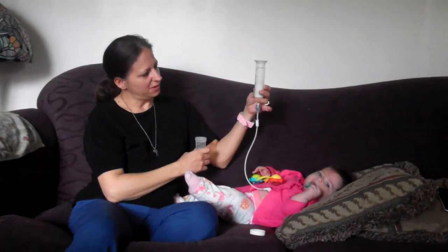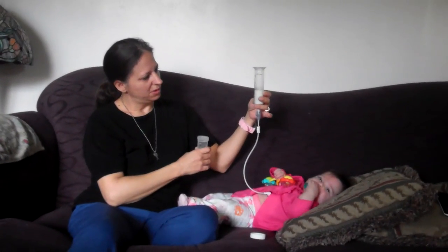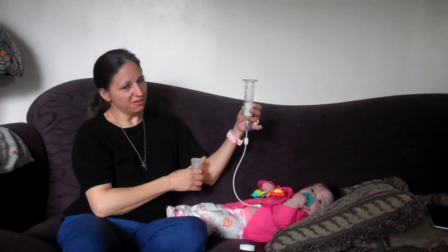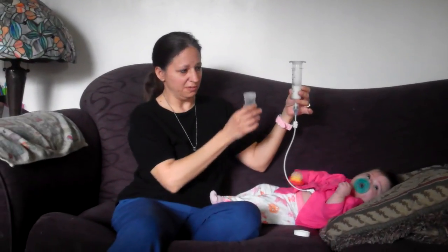It has that. So it's going kind of slow. But you can see that it's working its way down. And as long as she stays relaxed in her tummy, she'll be done here in just a couple minutes. Then I'll show you how you flush the tube.